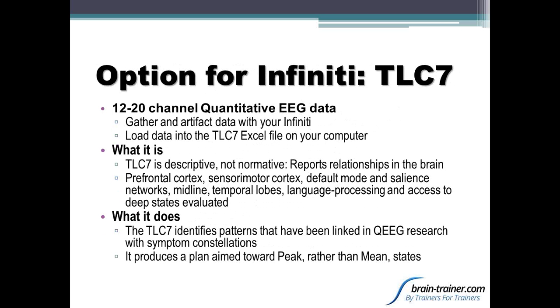So we have been working with Infinity for, wow, I don't even know how many years, a number of years. The TLC was developed, ported over into the Infinity by Francois back in the early 2000s. And so it's something which has been around for a while. There are people who use it, but the problem has been still is, okay, now I've got a lot of data, but I still don't know exactly what I'm supposed to do with it.